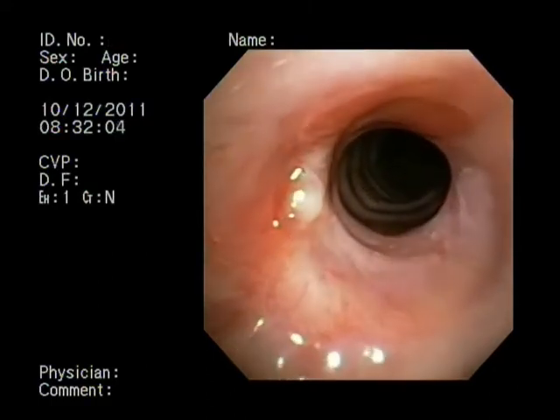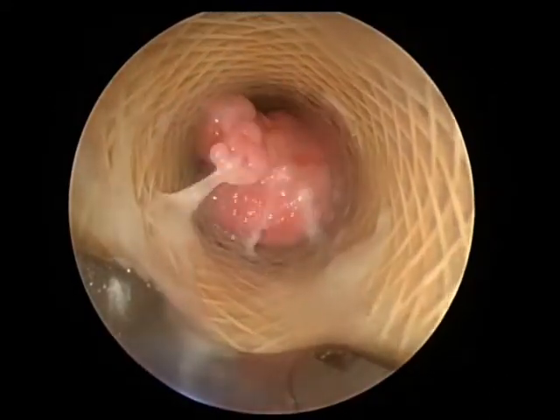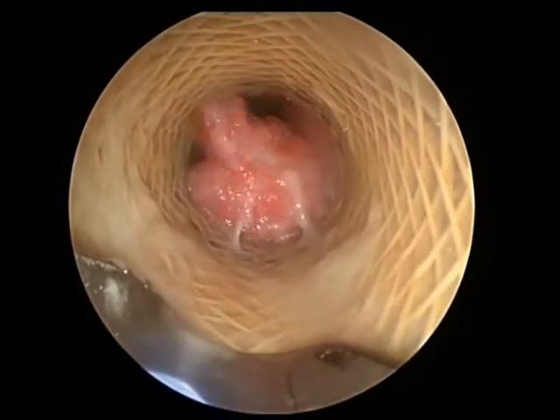Finally, in the last sequence, granulation tissue working as a ball valve obstructs the distal portion of the stent.